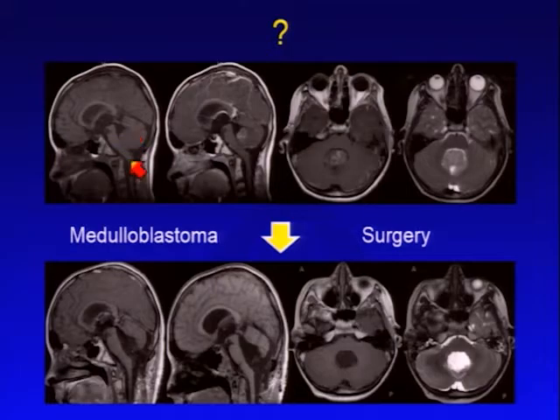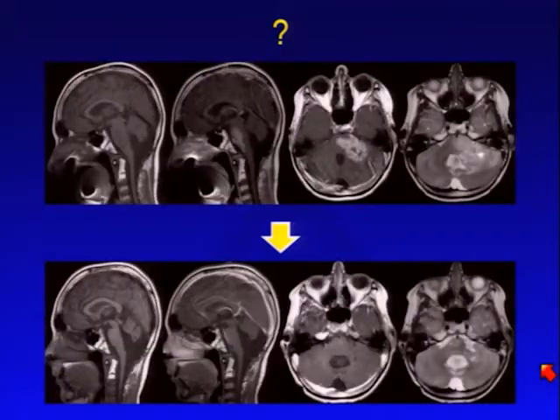This was a child with a medulloblastoma, a confirmed medulloblastoma, typical location, posterior to the fourth ventricle, midline. A so-called complete or radical surgery was performed. The fourth ventricle is nicely empty here, no tumor visible, everything looks great. The patient nevertheless had some additional treatment, and this is the follow-up imaging, and this is rather scary.